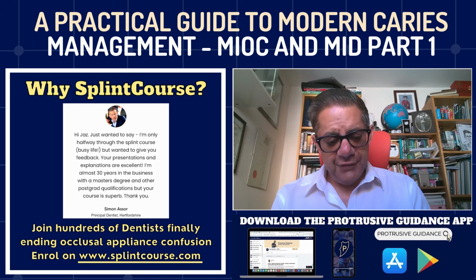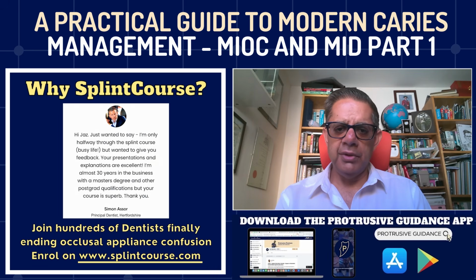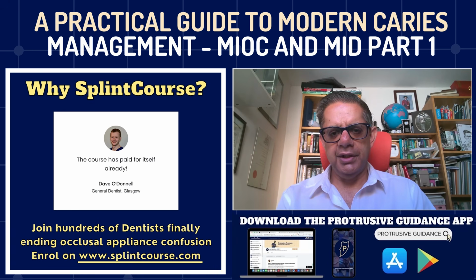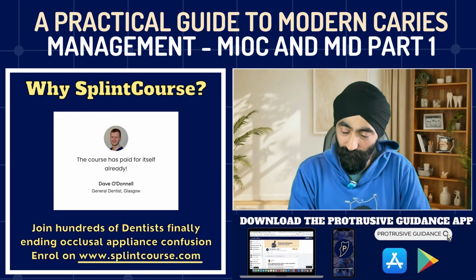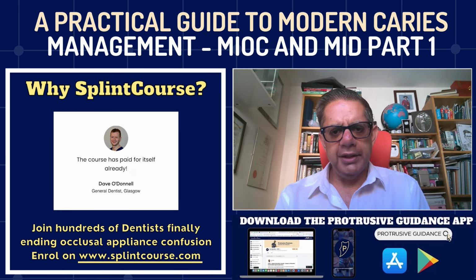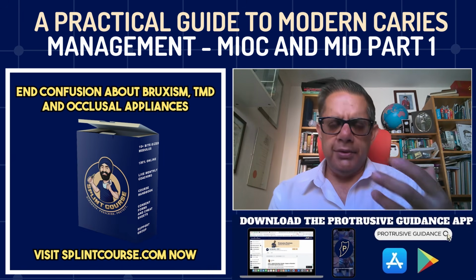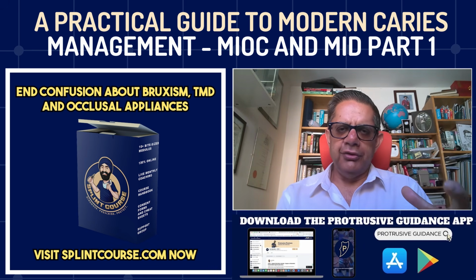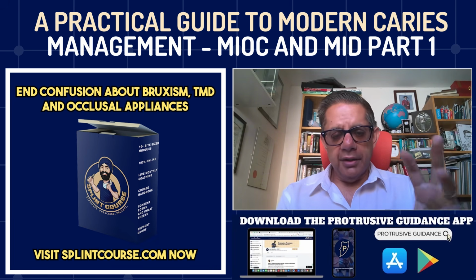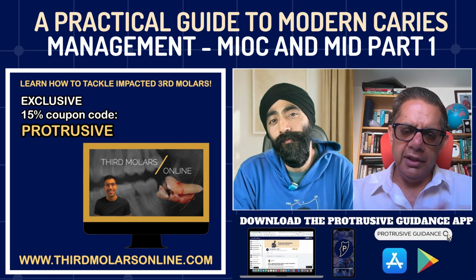So they exist. The physics is very clever, but the physics is not foolproof for any of these technologies. There is no perfect technology that will give you 100% sensitivity and 100% specificity when you're looking at a disease. Not one. So you always have to use your noggin to interpret what the device is telling you, and that interpretation is key. But what I will say is that if you're doing your clinical examination carefully with magnification and good lighting and everything else, you're taking good quality radiographs, and now with AI that potentially can help us as it machine learns the subtle changes in early lesions and things like this.